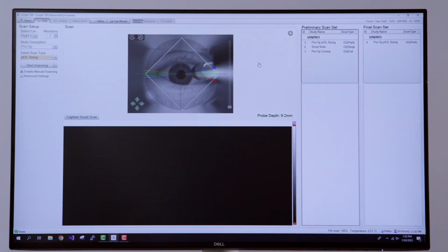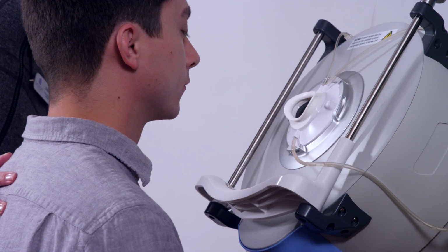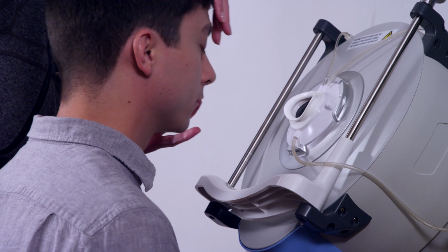You may need to adapt your technique depending on your patient's anatomy. Here are a few examples. If your patient has deep-set eyes or prominent facial anatomy, here are a few options to consider. You may try lowering the level of saline in the EyeSeal to allow the probe to move closer toward the eye. You may even see the waterline in the camera view. You can also drain the EyeSeal cup. Then before introducing the saline, have the patient reposition, pressing quite firmly into the EyeSeal.